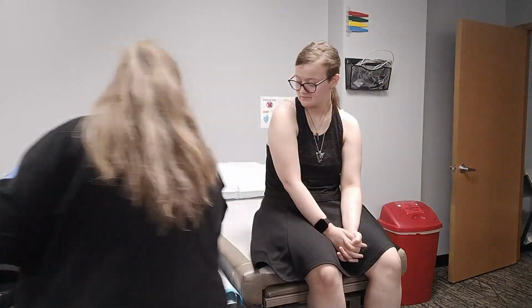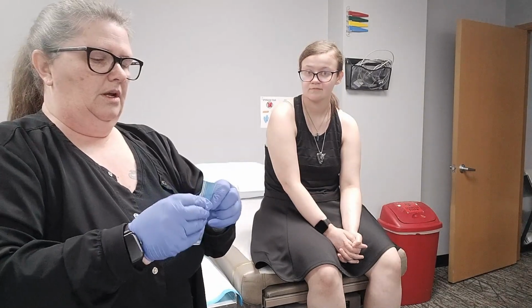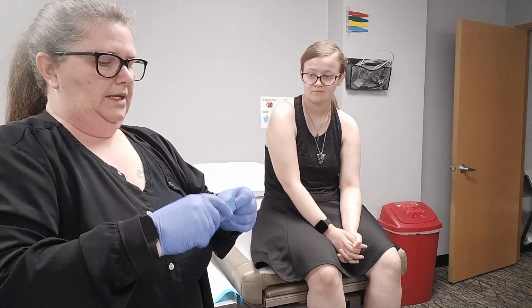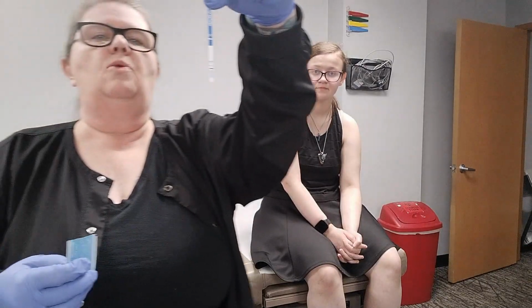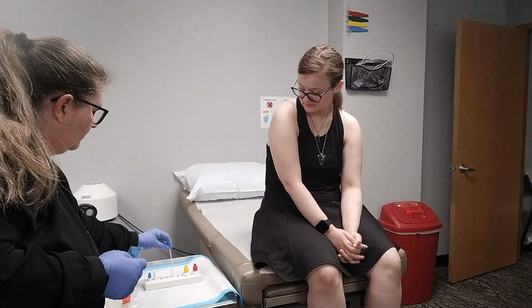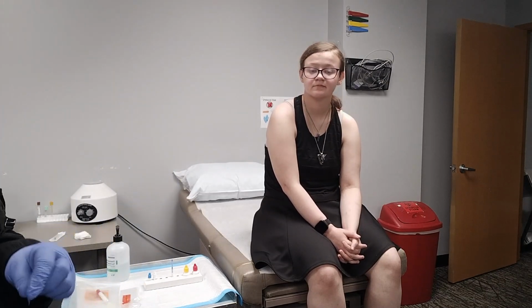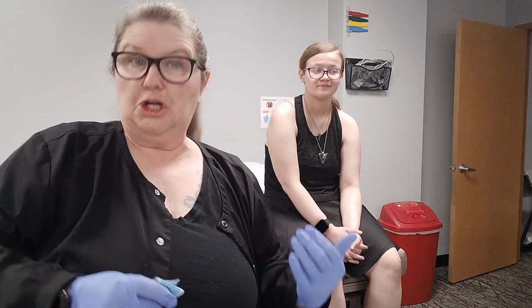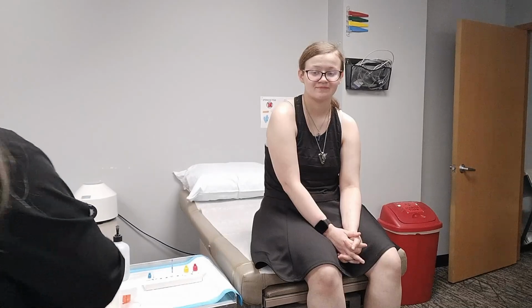And then we're going to go ahead and take our test strip. These are individually wrapped. Go ahead and get that out of there. And if you notice on the test strip, there's little wavy lines at the bottom. The little wavy lines are what goes into the test tube. And then per the directions on the box, we are going to wait 5 minutes for that to, I always call it cooking, but we're going to wait 5 minutes for that to come up with a result for us.